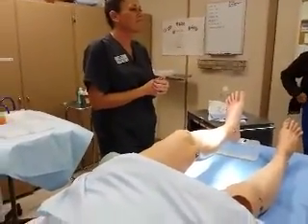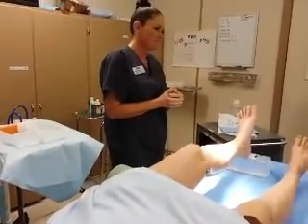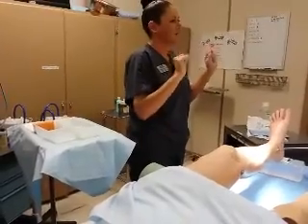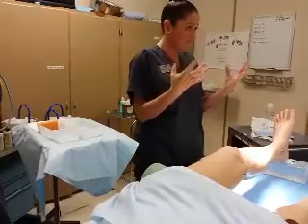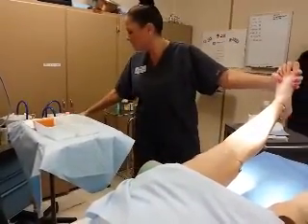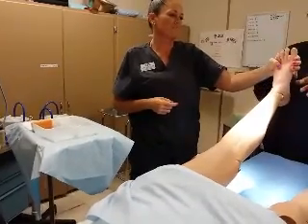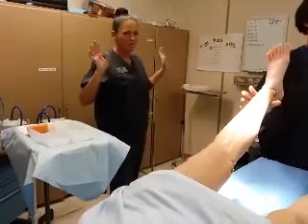I know you're not going to leave that there during surgery, right? How would you do that? What would happen is you say, okay, I'm ready. When the surgeon comes with his drapes and everything, the circulator, with her sterile gloves on, will pick up the leg, move this out, and hold the leg for the surgeon. Stockinette, put it on, and then he'll grab the leg, the scrub will come over, and they'll drape. And we're way back out.